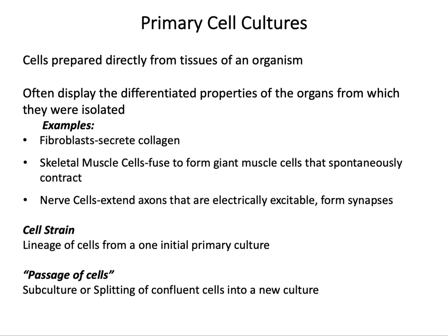So this splitting of the cells into new culture vessels with fresh media is known as passaging the cells. One interesting phenomenon we are going to observe later is that immortal cells or cancerous cells often do not exhibit contact inhibition like the mortal primary cells in culture, and can grow on top of each other and often in suspension, or floating in the medium without even attaching to the surface of the vessel. We will revisit this in the last module of this course when we will study cancer cell biology.